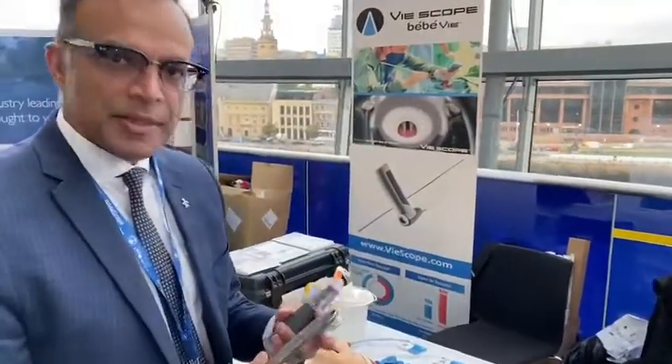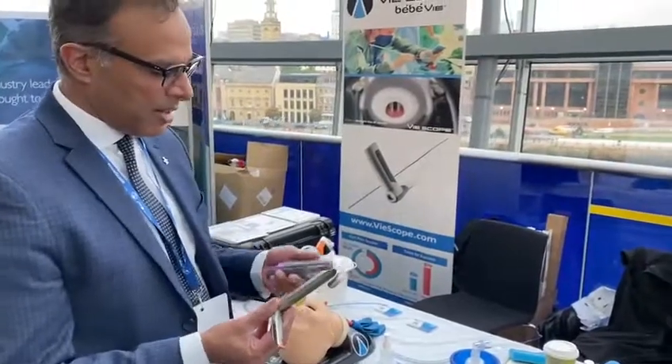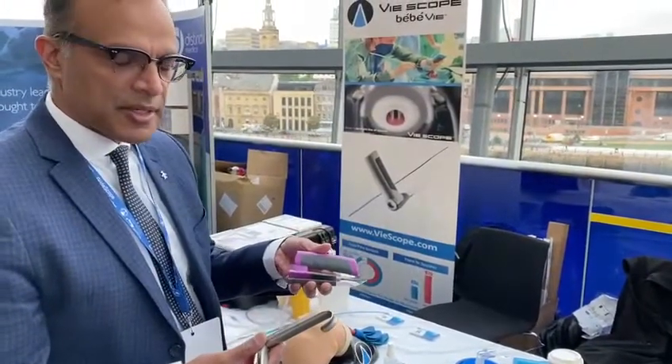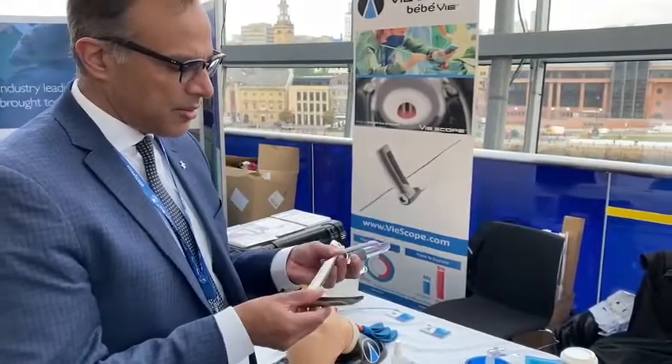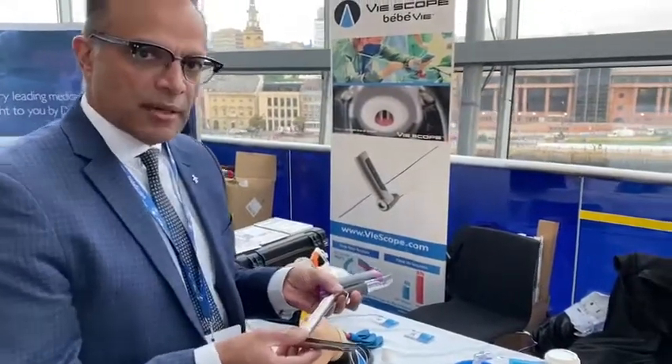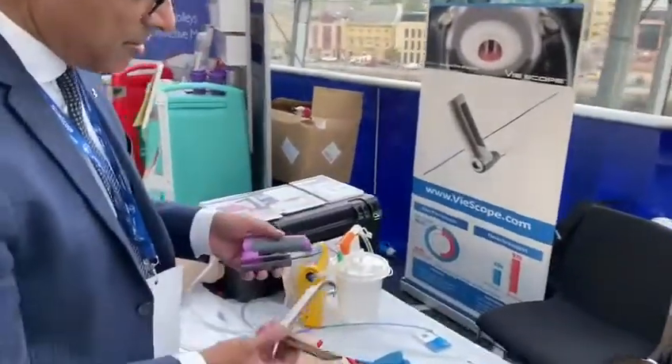I'm Nilesh Bassam, one of the founders and CEO of Adroit Surgical, and I'm going to talk about our new bébé Vie pediatric laryngoscope. It's based on the Parsons laryngoscope, a very common tool. ENT and thoracic surgeons use it, but we're going to use it for intubation.